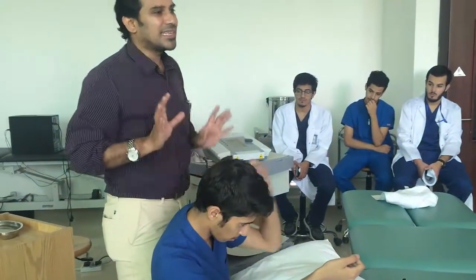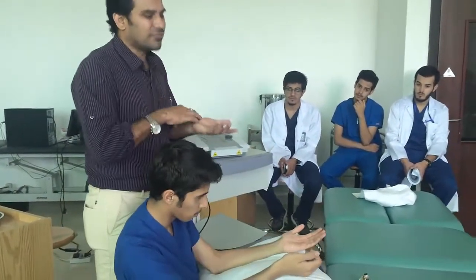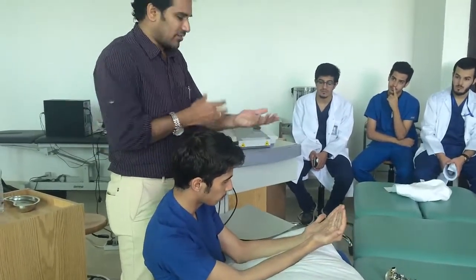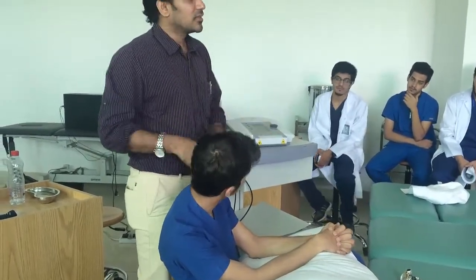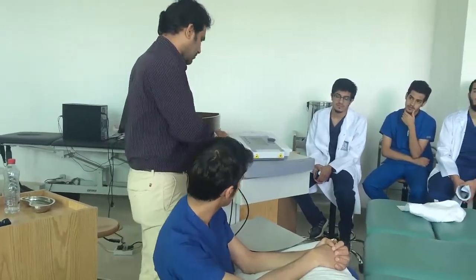Okay? You should not sleep. Okay? Warnings. If the patient is not comfortable, if he is getting pain, if he is not comfortable in position, if he is having any kind of burning, because burning will not happen in this. In case the patient is not comfortable, he should report. So once we have to start the treatment.